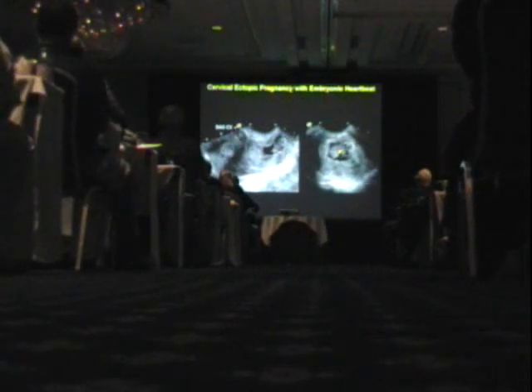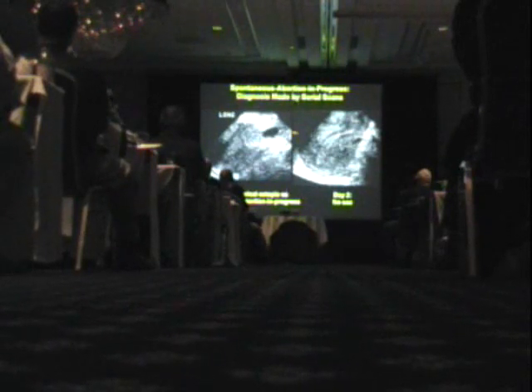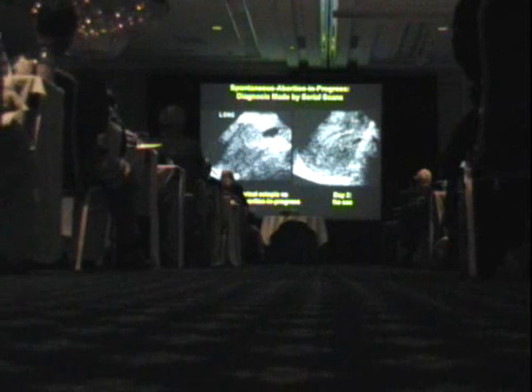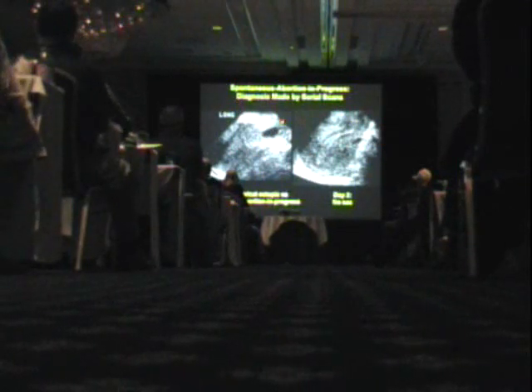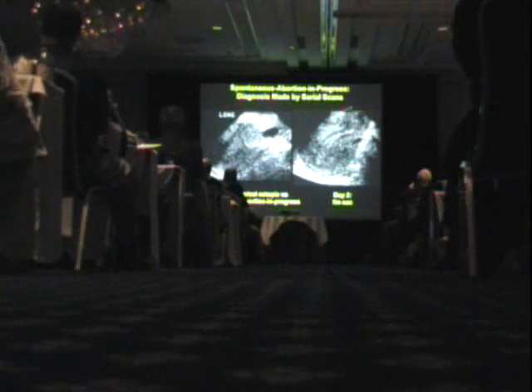Well-formed sac with a heartbeat, this is a cervical ectopic pregnancy. In this case, there's a not terribly well-formed gestational sac. No embryo was seen within it. We were quite sure, almost 100% sure, this was a spontaneous abortion in progress. But you might want to be 100% sure if you're dealing with something as potentially life-threatening as a cervical ectopic pregnancy. Waited a day, and it confirmed our suspicion. It's all gone.